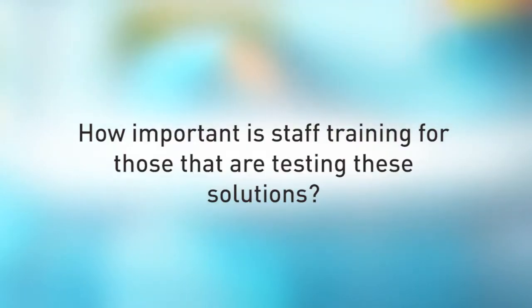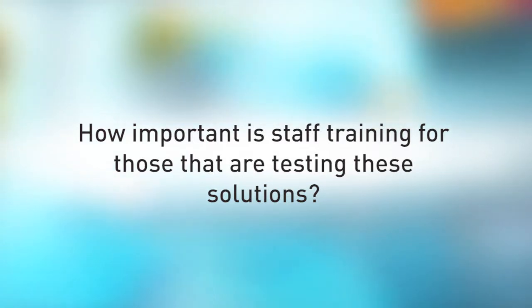So, how important is staff training for those that are testing these solutions? The joint standard from the American National Standards Institute and the Association for the Advancement of Medical Instrumentation note that staff who are responsible for using chemical monitors and test strips should be fully trained.